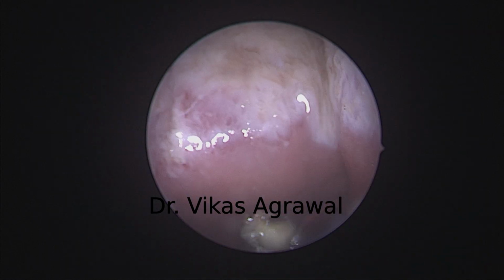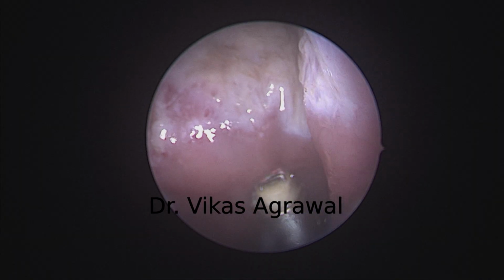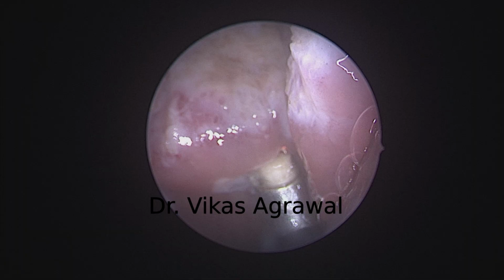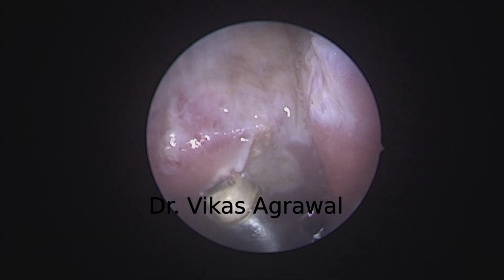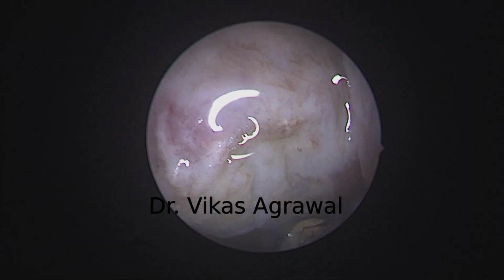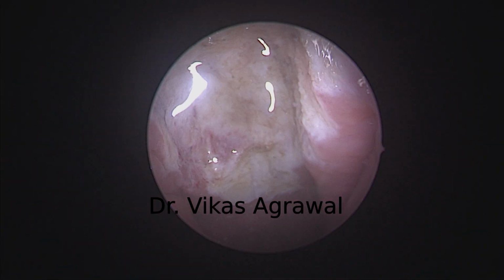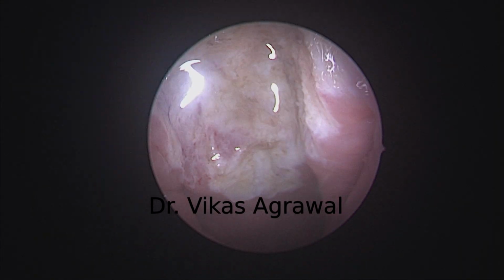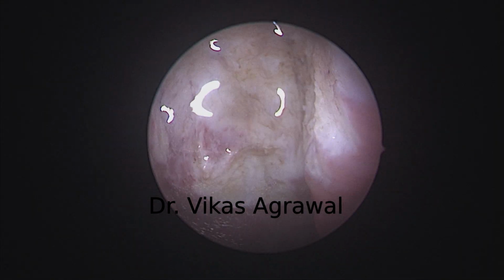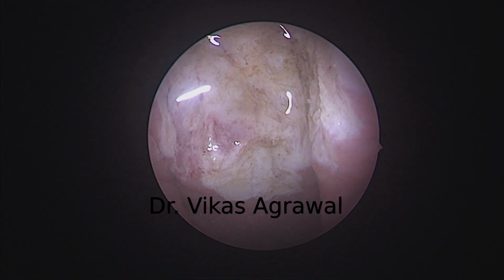And this is the inferior boundary, the Passavant ridge. You can see some lymphoid tissue ending over here. This is the Passavant ridge. Let me focus my camera a little better. All right.